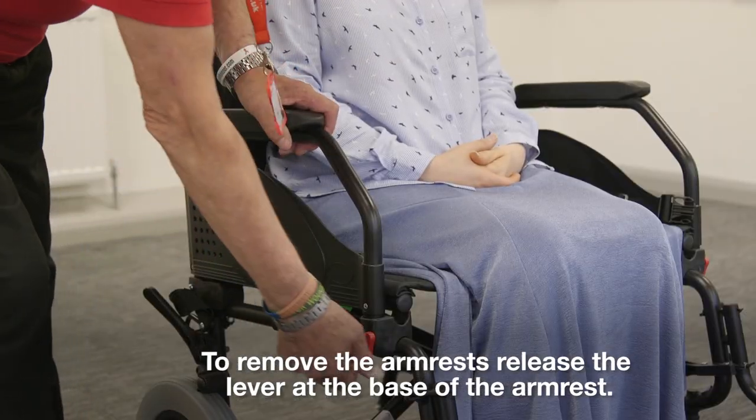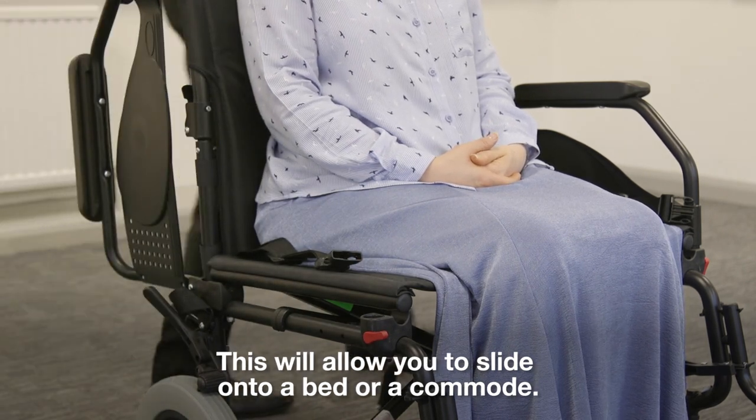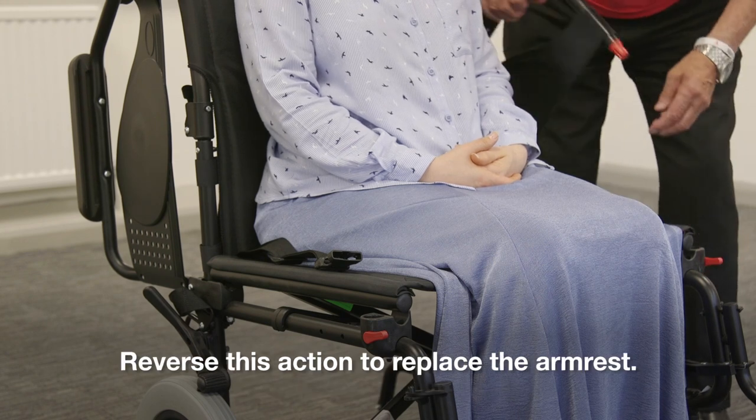To remove the arm rests, release the lever at the base of the arm rest. This will allow you to slide onto a bed or a commode. Reverse this action to replace the arm rest.